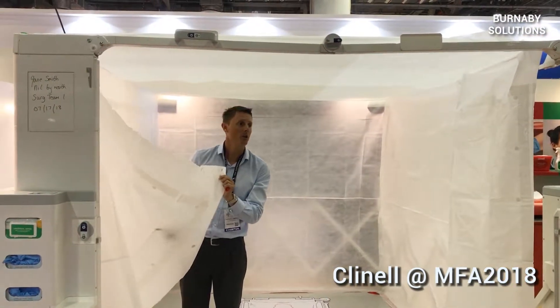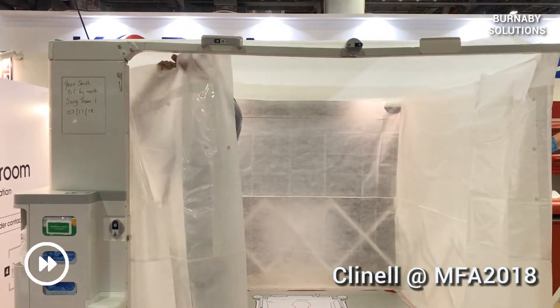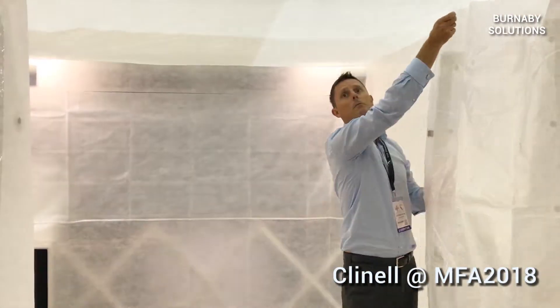And I'll open the curtains so you can see what I'm doing inside. I'm going to attach the door as well.